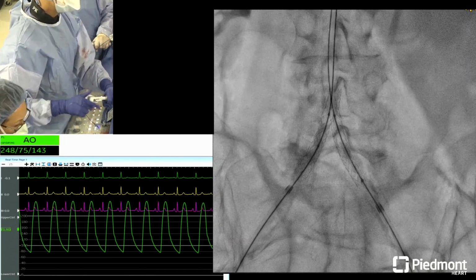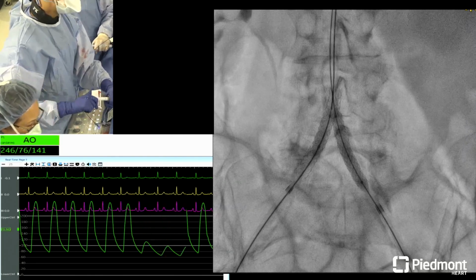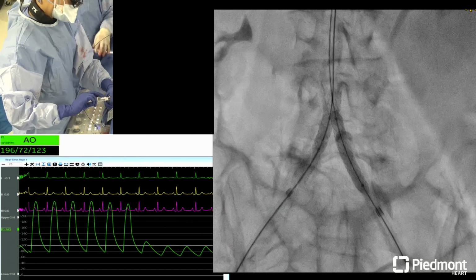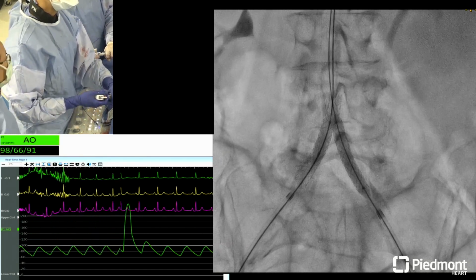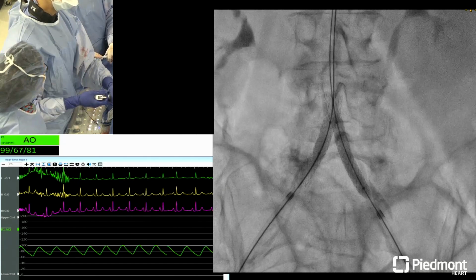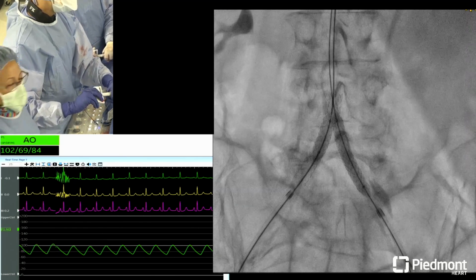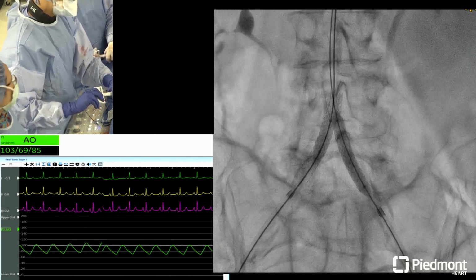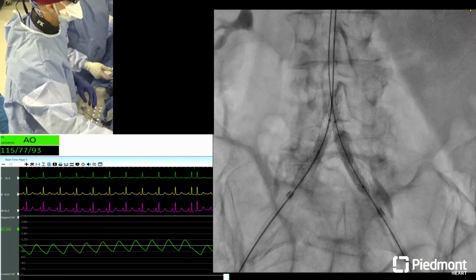So I think the key thing for this case is really about getting the patient prepared, critical on informed consent, really making sure you have a strategy plan, having plan B, because of course plan A didn't work. I'm at 12 if you want to go up to 12. And then being able to really get good access below. 3, 2, 1, down. 10 on the left, 12 on the right.